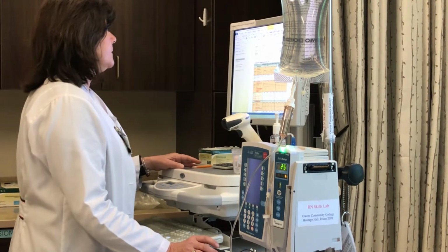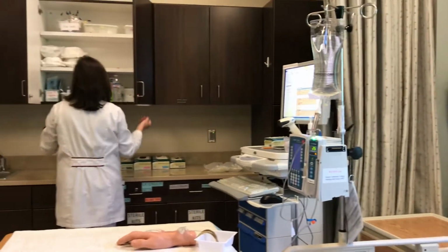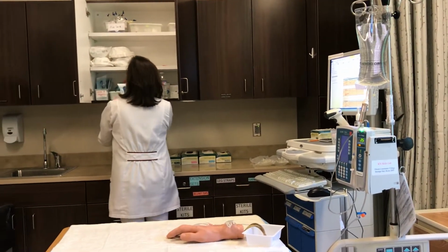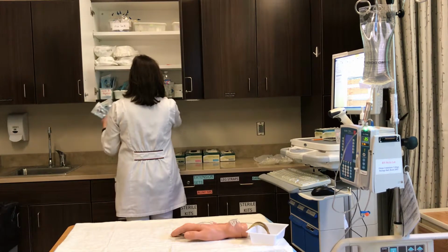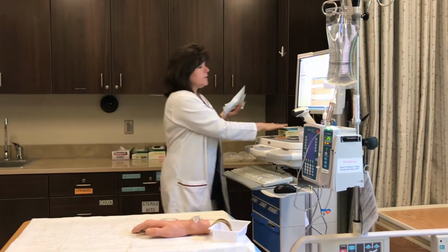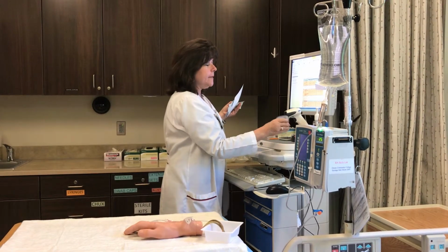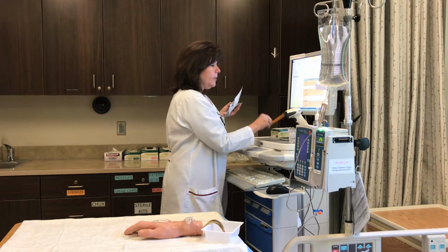Gather necessary equipment and supplies. Our equipment will be in the cupboards at the side of the room. I'm grabbing 2 secondary tubings and labels. My alcohol swabs and swab caps are on my WOW, along with a calculator and paper and pencil.